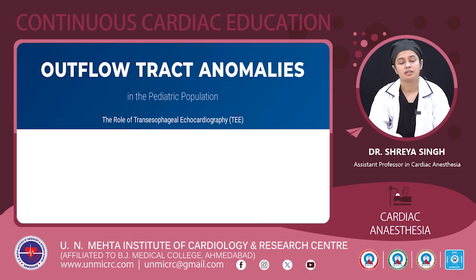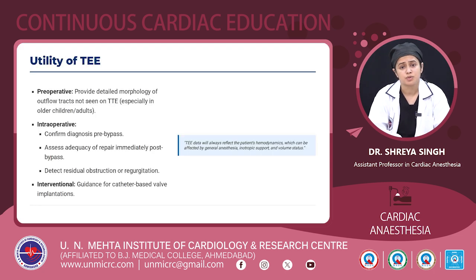Good morning, everyone. Today I'll be talking about the outflow tract anomalies in the pediatric population and the role of transesophageal echocardiography in it. So talking about the utility of TEE. So where can TEE help us? It can help us in the preoperative period, the intraoperative period, the postoperative period, as well as in interventional procedures.